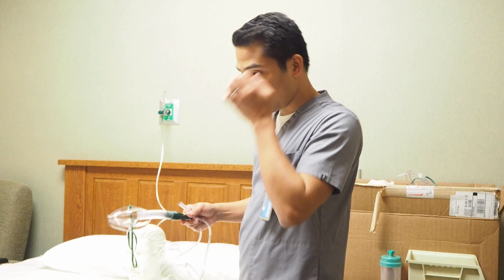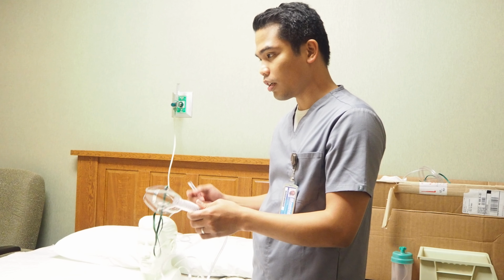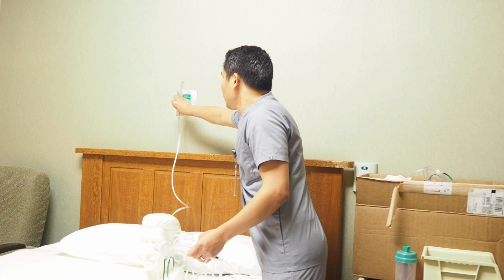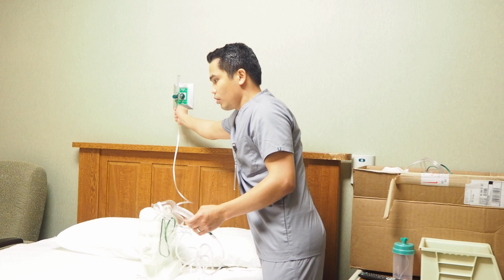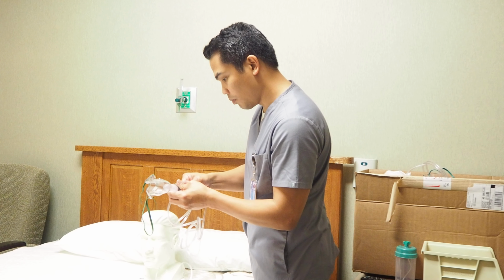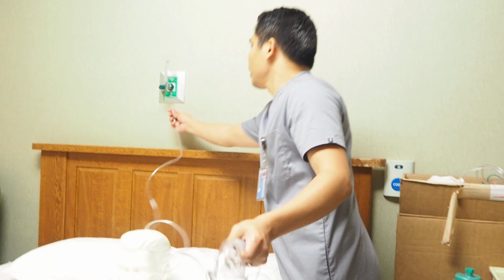It could have been better if we used a simple mask, but with a simple mask, the patient might rebreathe carbon dioxide, which might be worse for the patient. Because the flow is 3 liters, 3 times 4, we can set it up with about 31% FiO2 with a Venturi mask.